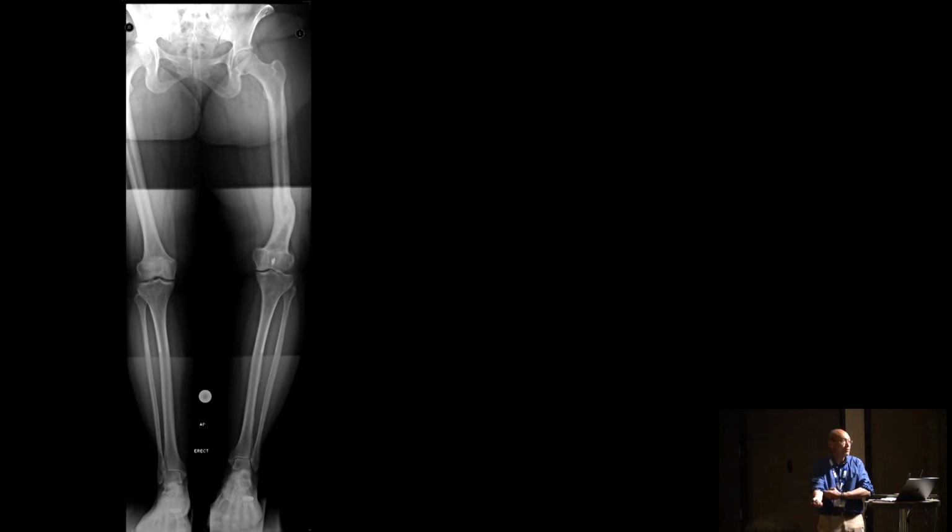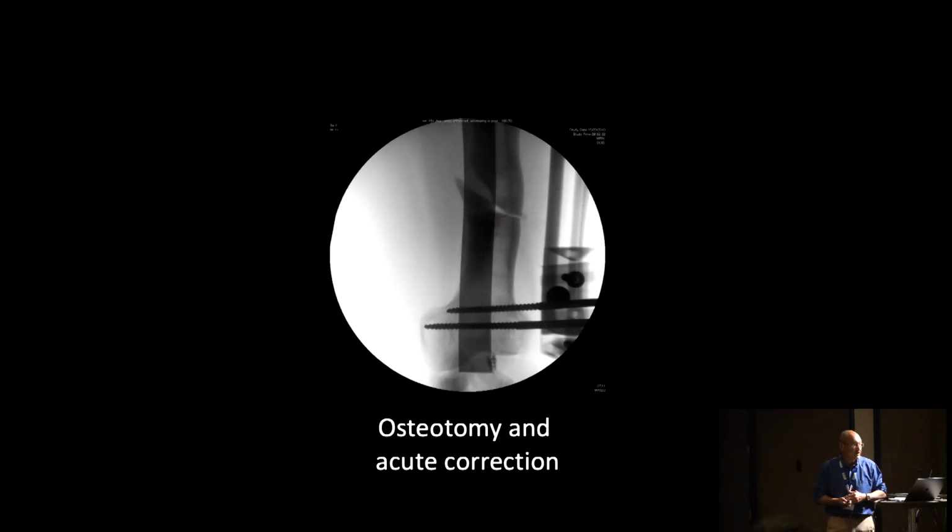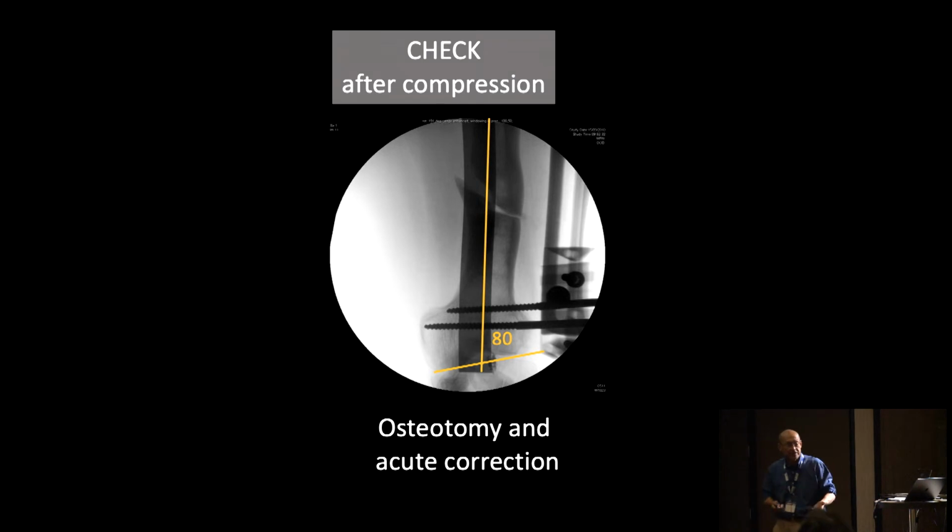It is almost similar to one of the previous cases shown that was treated with an intramedullary nail and a hexapod. But using a different technique, you have your half pins perpendicular proximal, half pins perpendicular to the anatomical axis distal, and you would want to place your half pins parallel to the sagittal axis in the lateral view. And again, because I'm planning to use an intramedullary nail, I will position my pins posterior to the trajectory of the nail. So this is the intraoperative view with an intraoperative check of the final angle that you achieve.